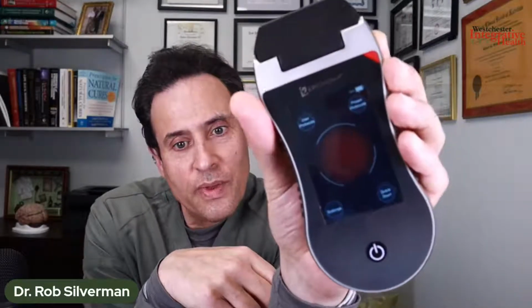So I'm going to go in. I'll let you see the front. I'm trying to get it right in there. So I'm going to do what we call the quick start, and I'm actually going to program it now. So many people asked me about the frequency yesterday. We had a great live on frequency. Steve Shanks and Travis Hammonds from the Erchonia research team did a great job.